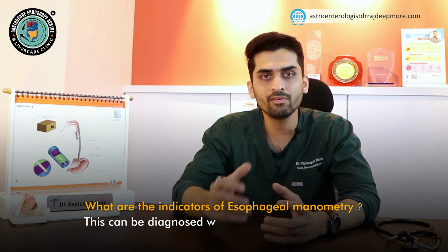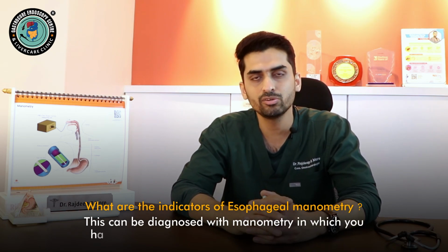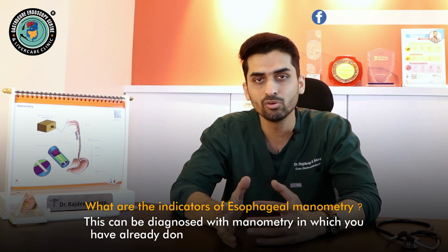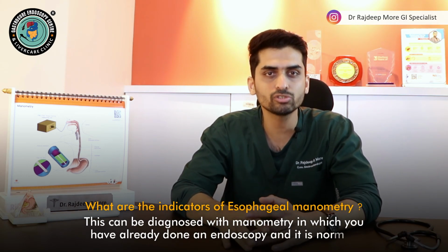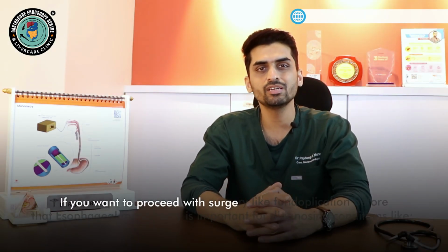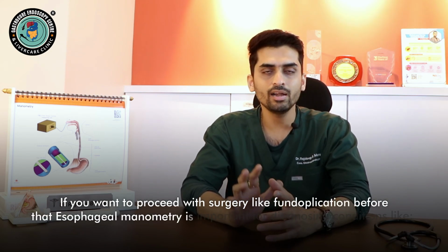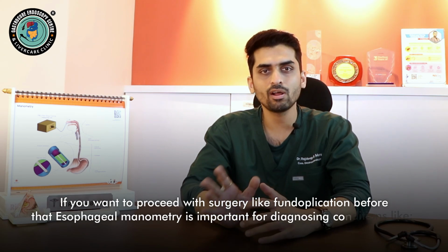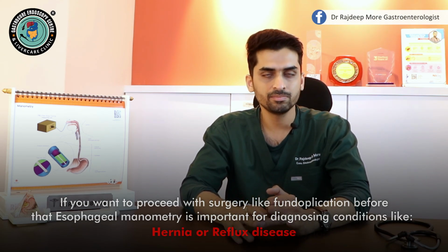Whenever the movement of the food pipe or the esophagus is not normal, this can lead to similar chest pain, which can be diagnosed by a manometry, and in which you have already done an endoscopy and it is normal. The other thing is, if you want to proceed with a surgery like fundoplication, before that a manometry is important for diagnosing conditions like hiatus hernia or reflux disease.